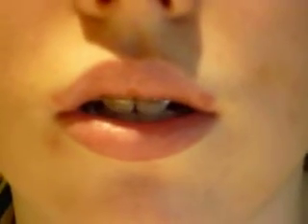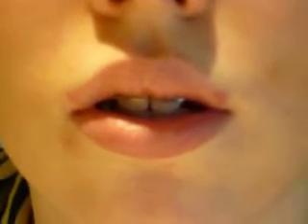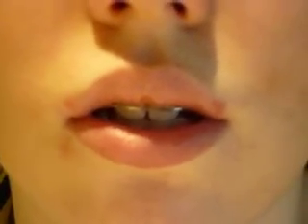So this is now about three weeks and we're hoping to get your jaw even further forward. I think your teeth will move out a little bit. And when they do move out, that'll allow the jaw to come forward because she's lost a few teeth. Have you gotten any of the other dental work done yet? No. We'll see you in maybe two or three more weeks after you've had a chance to really get your back teeth to grow in a little bit.